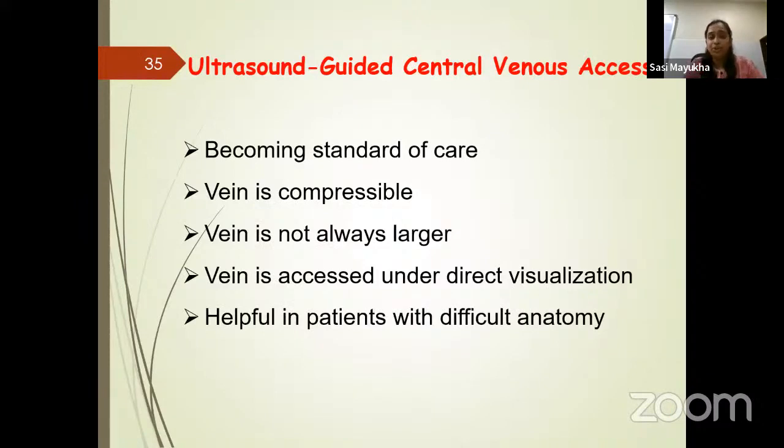So as I was telling you earlier, ultrasound guided central venous access has become the standard of care now. Veins are compressible. The vein is accessed under direct visualization, and it's very helpful in patients with difficult anatomy.